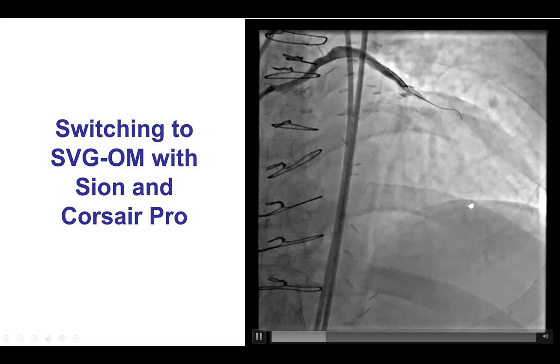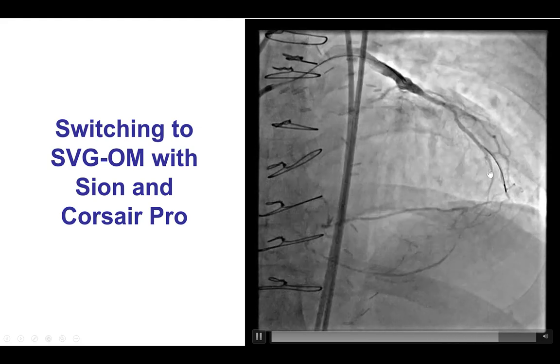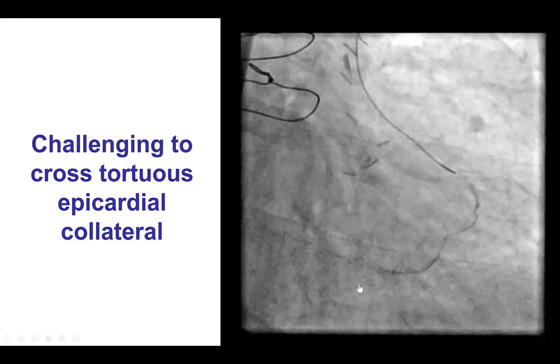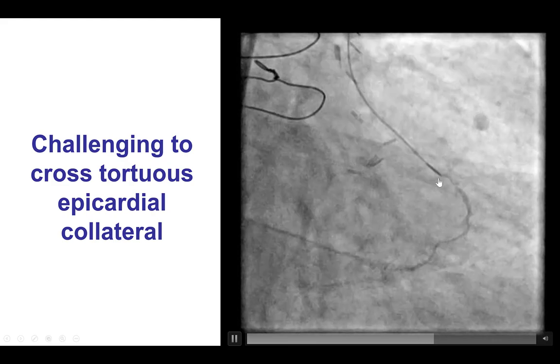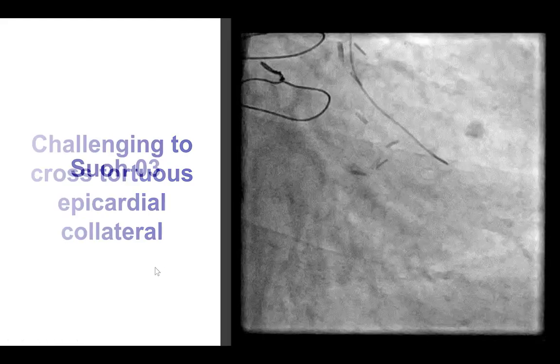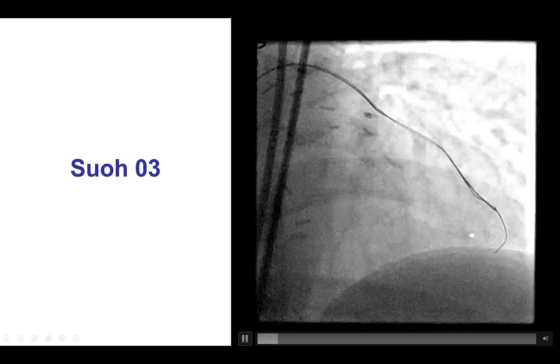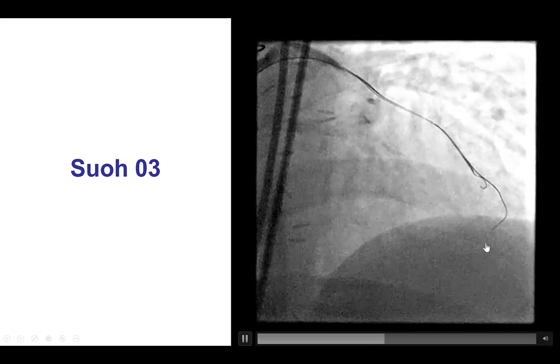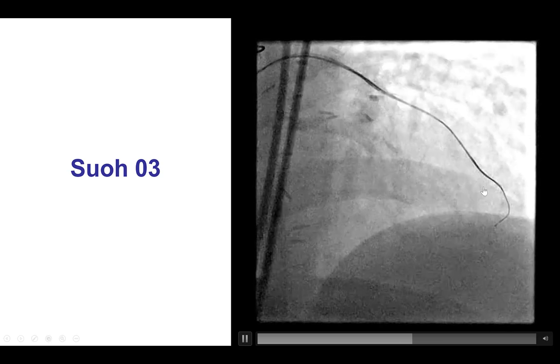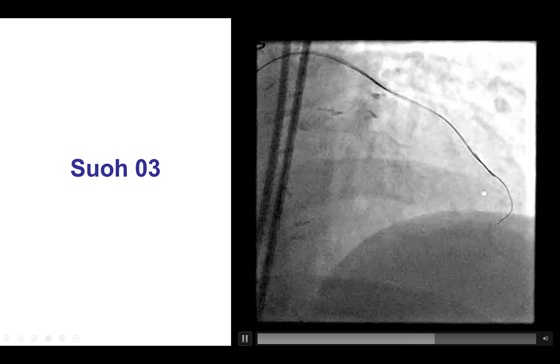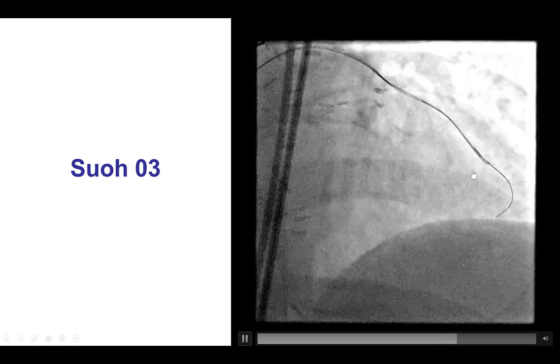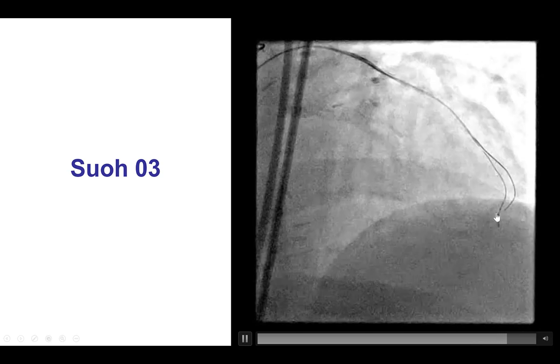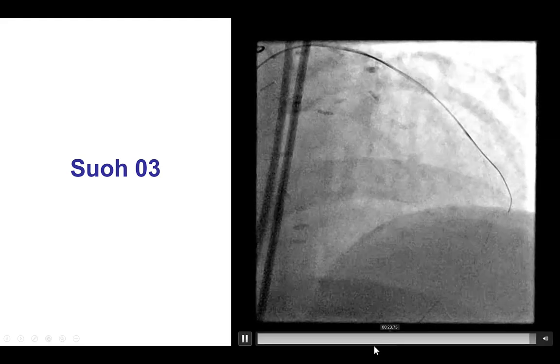Although this collateral appeared to be favorable, there was a significant bend at the early portion of the epicardial collateral going to the posterior descending artery that provided a lot of difficulty in crossing. This is an injection through the microcatheter — this is a Turnpike LP — and we do have significant tortuosity early on. We did multiple attempts to cross this collateral using a SUO-03 guidewire, which is the guidewire of choice for these tortuous epicardial collaterals. It was hard getting into the collateral, but the wire eventually made the bend and successfully crossed all the way to the right PDA.